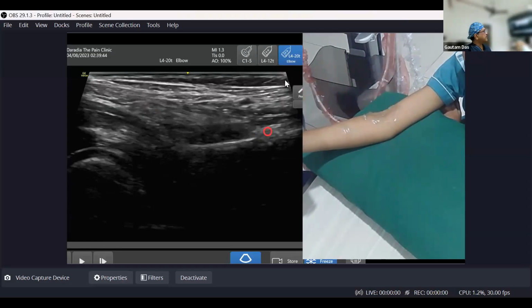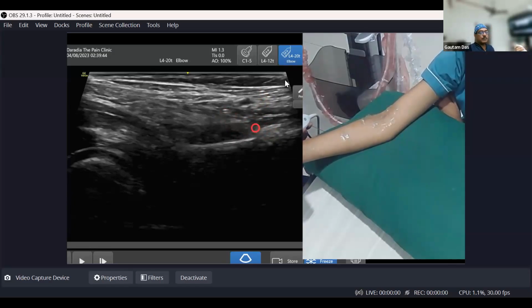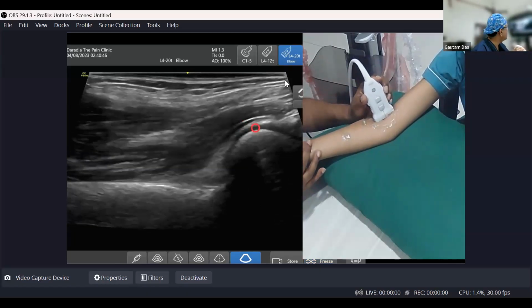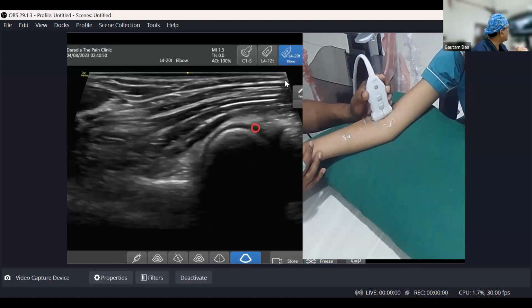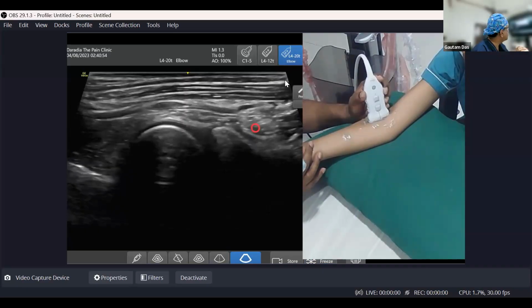So what is the advantage of that? The advantage is that even at this point where it is getting attached, you can come and give the injection there. And another trick you have to remember: this is a tubercle where the distal end of the biceps is getting attached. It is on the most medial side. And that is the reason why, again, I'm showing you. So this was your capitulum. This was your radial head. So this was your head of the radius.